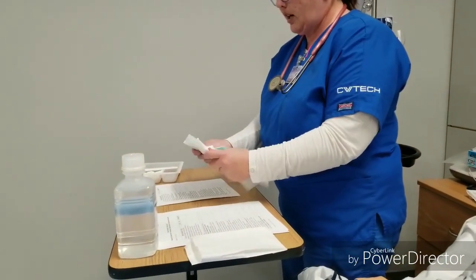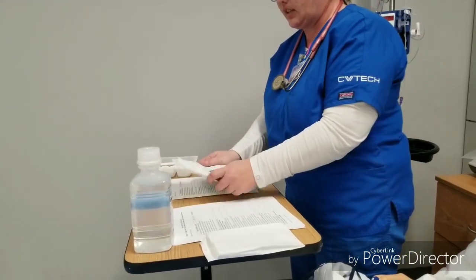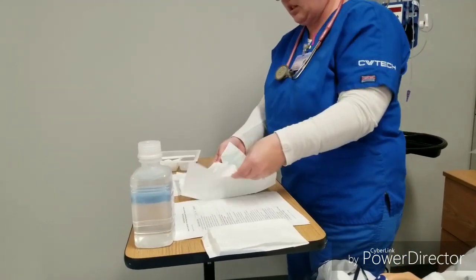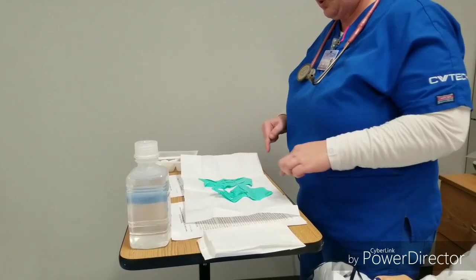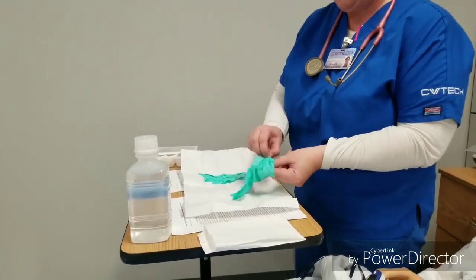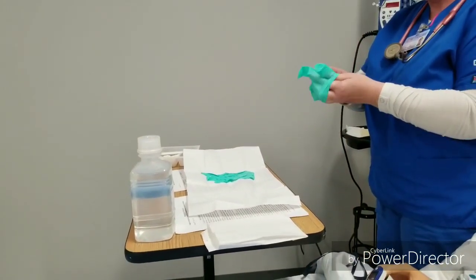You want to assess the chart for any allergies such as latex. Remember your 1-inch border again. Dominant hand, I'm right-handed, so I'm going to apply these. Step back so you don't contaminate your field.